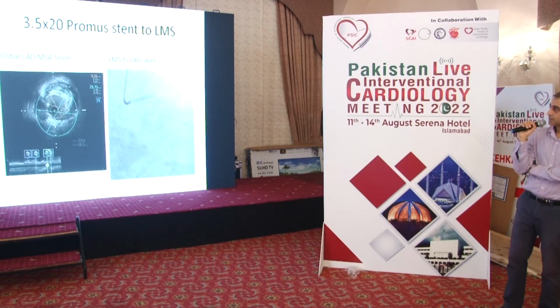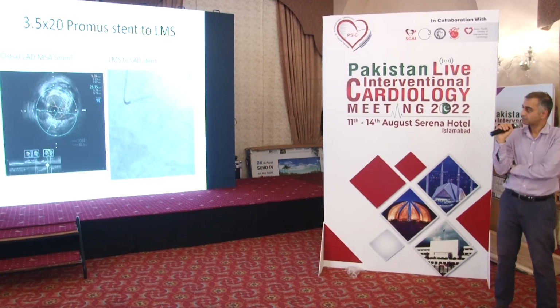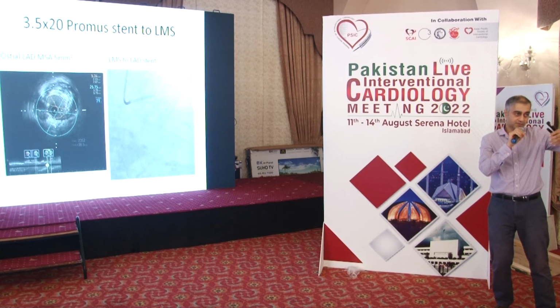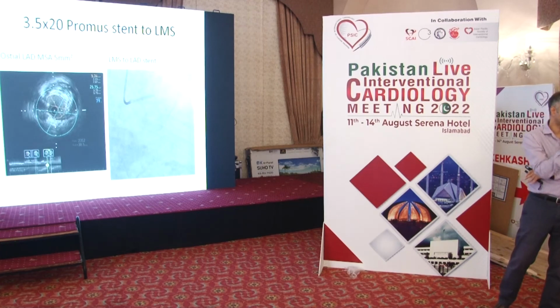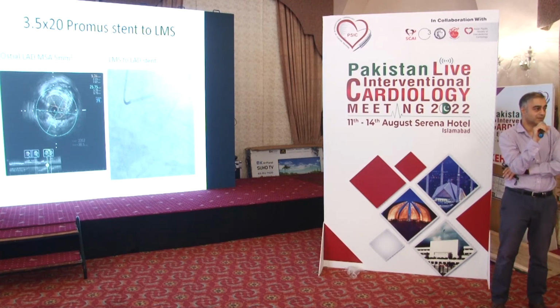So here we are. So that's the vessel. This is ostial LAD. It's coming out at 5 millimeters. So pull back from the LAD into the left main stem. Just at that juncture from LAD to left main stem, the area was 5 millimeters squared. So I think that then tells you that actually you do need to do something about this, and probably the chest pain that he's having is related to this severe stenosis that he's got in his distal left main stem.